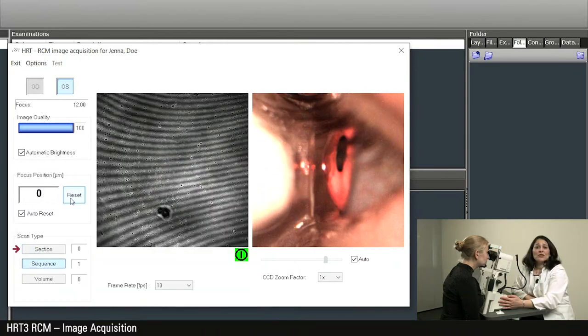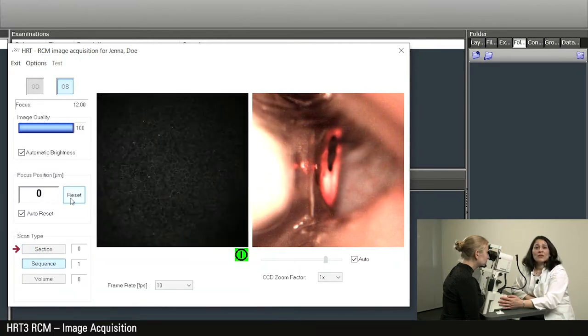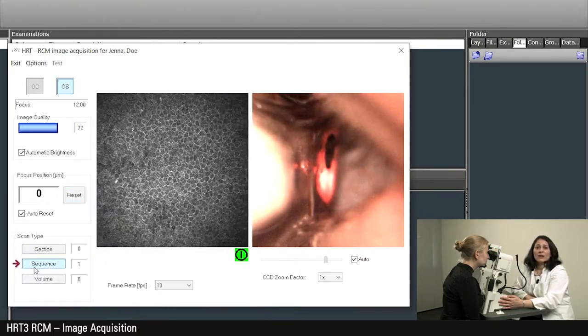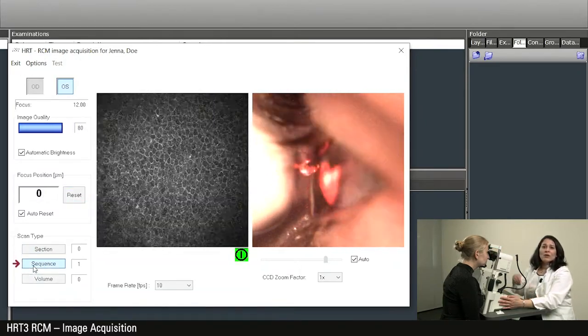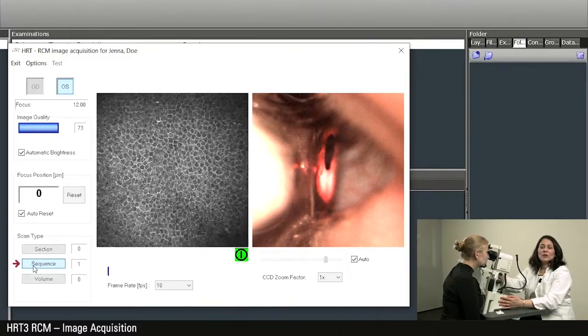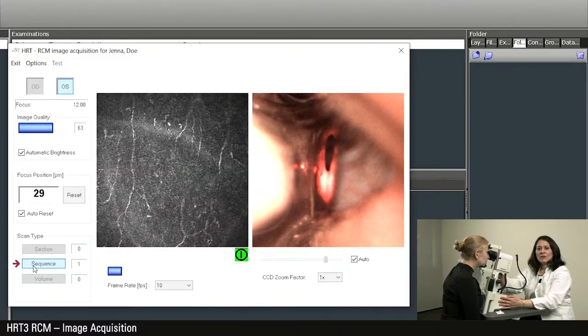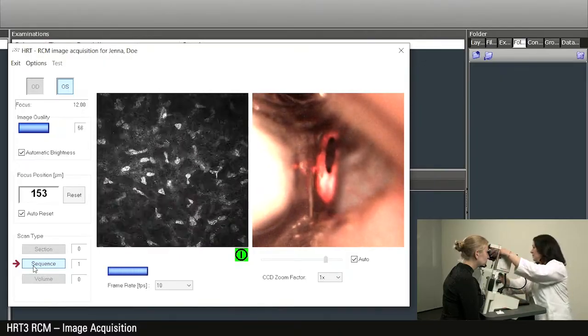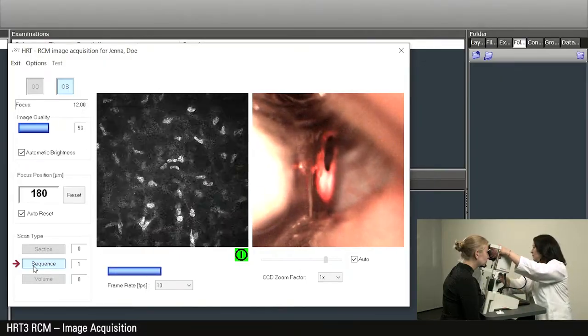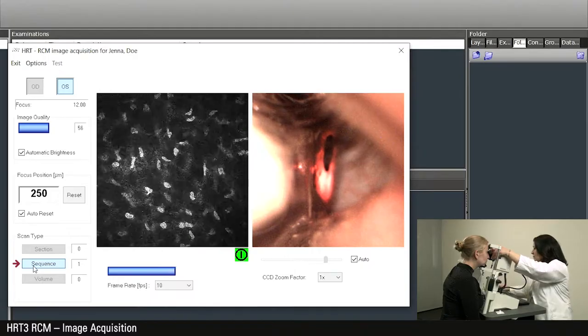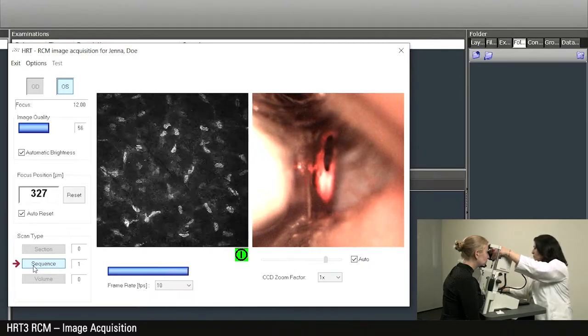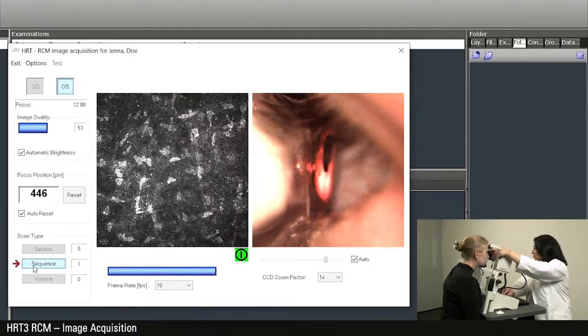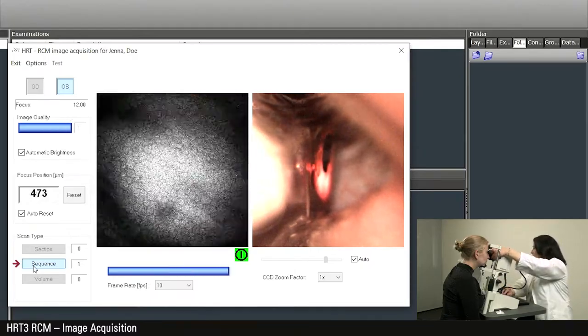Now I will show you the second acquisition option, which is the sequence selection. You record a video when you press the acquisition button. While the video is running, you can adjust the focal plane as desired on the objective wheel and thus display different corneal structures within the video.